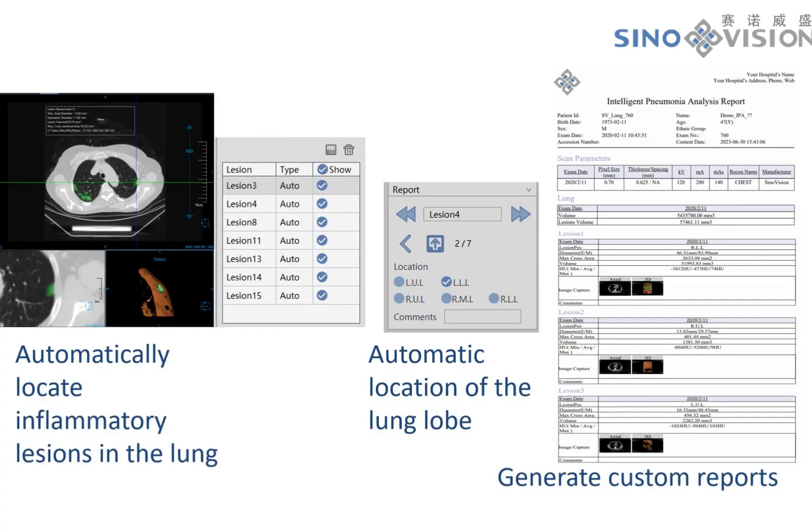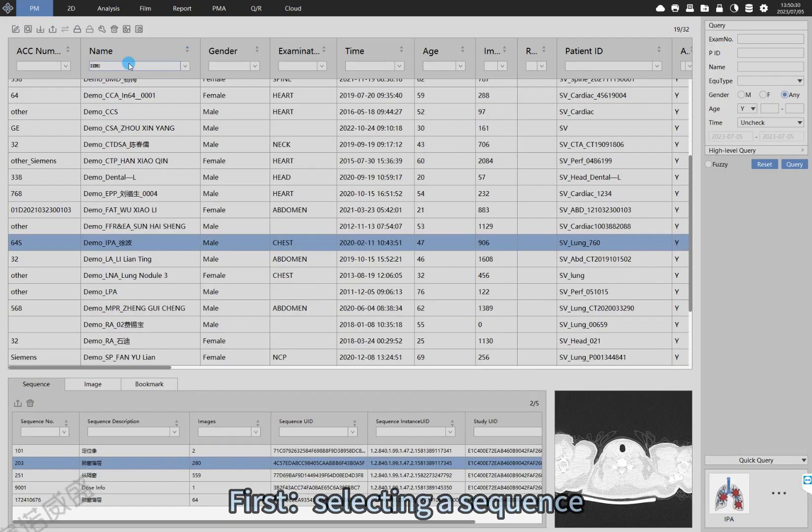Today I will introduce the plug-in of the Intelligent Pneumonia Analysis, IPA. It can auto-tag single or multiple inflammatory lesions in lungs, calculate the area of involved lung tissue, and mark the location of each focus. In the end, you can get a customized diagnosis report.